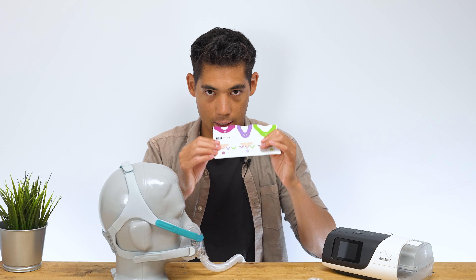On the front I'm a little disappointed with the overall usability. The front has clips — they're fairly easy to pull out and put back in, but nowhere near as easy as magnets. Look at the Dreamwear mask — how easy are magnets? Here's the F20 by ResMed — again, magnets. With the Evora, the same quick-release motion is just not going to work.